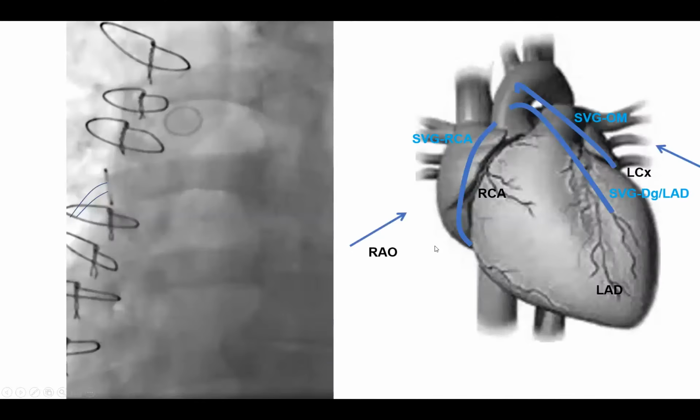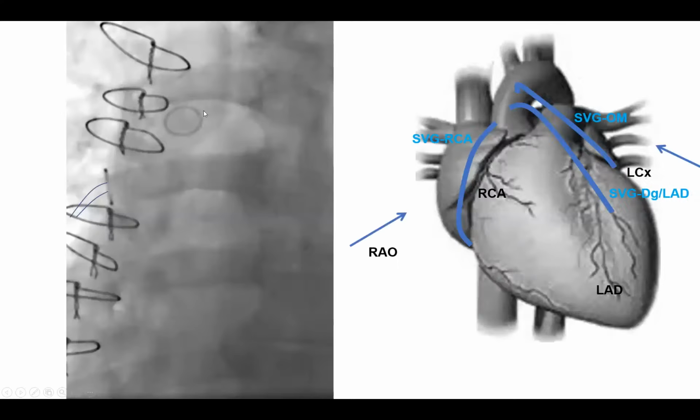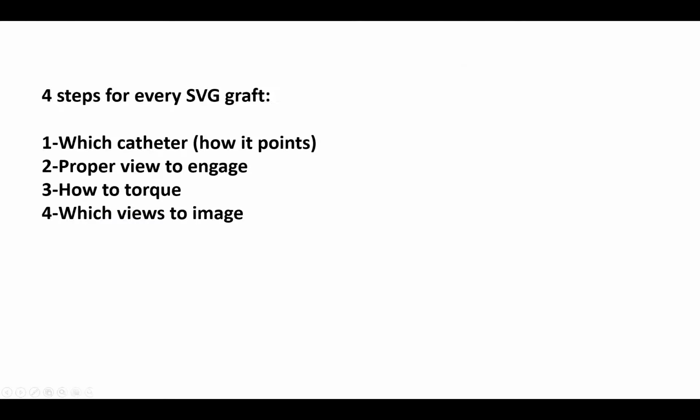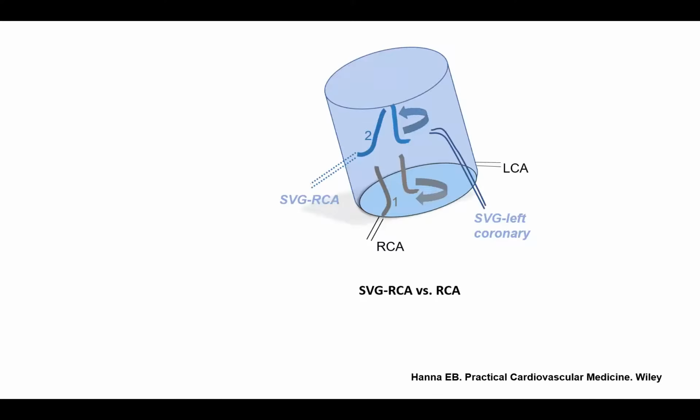Okay. All right. So now the third idea, how to torque it. So we got the multipurpose, we got the LAO for a right graft. Now LAO for right graft, how to torque it, clock or counterclock? 90% of the time I get the wrong answer on this. Counterclock. Yes, good. It's counterclock rotation. And I will explain, it's counterintuitive. That's how, remember, graft to the right, counterintuitive, counterclock.